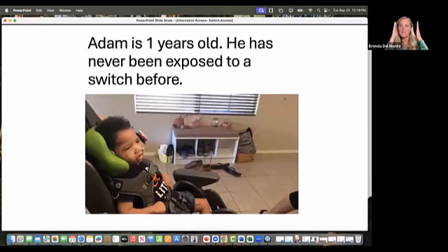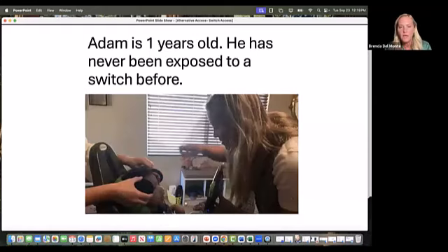And every time he's hitting it, he's getting a different choice. When he hears the one he wants, he has to hit that's the one switch. So my cueing is that's the one, or something different. And that way, no matter what series of vocabulary you're sequencing through, it's something different, something different, something different. That's the one.